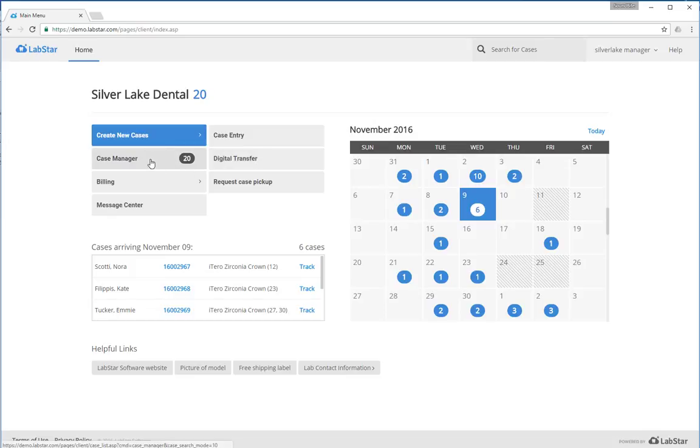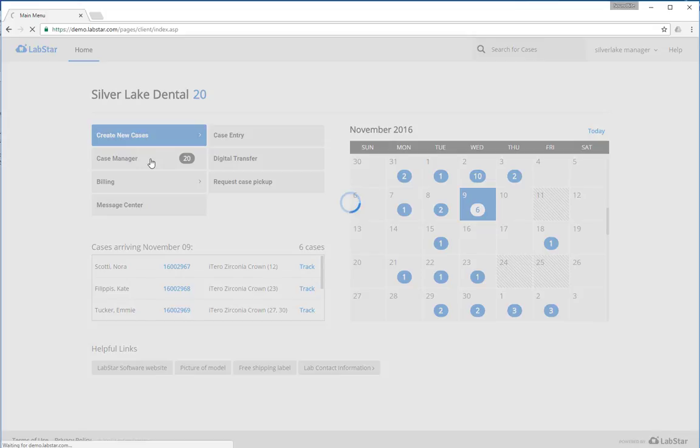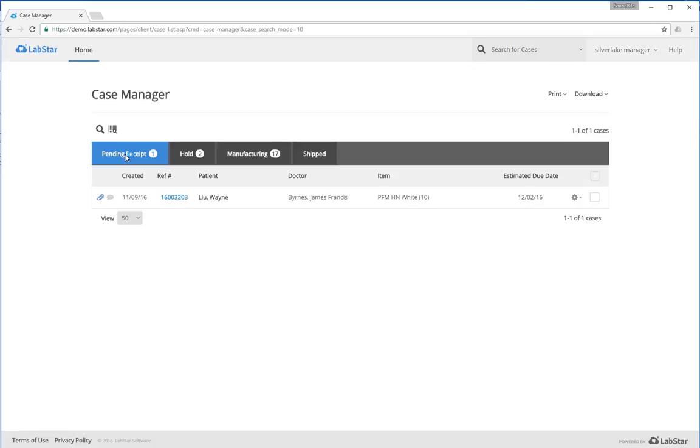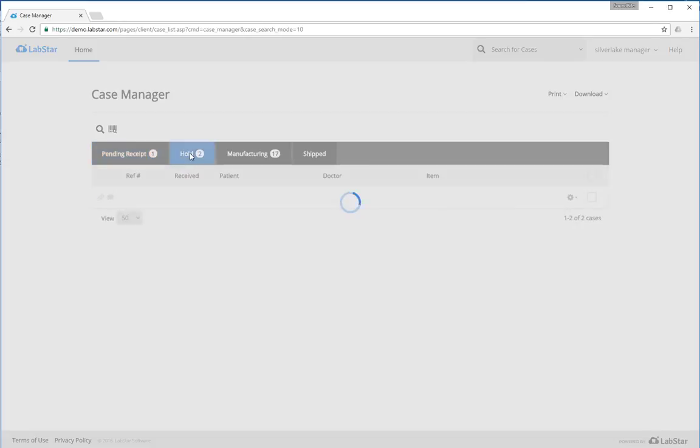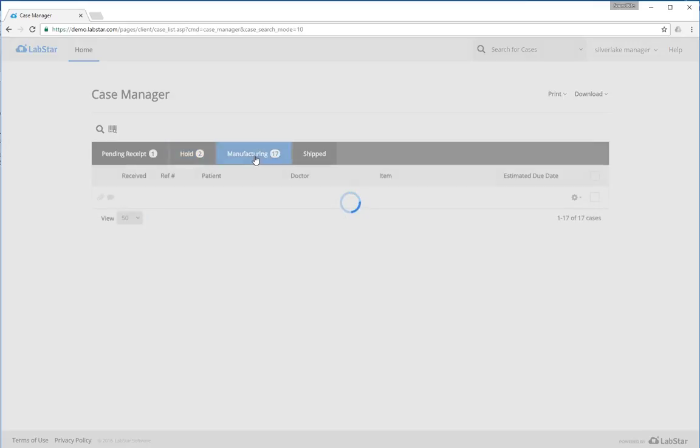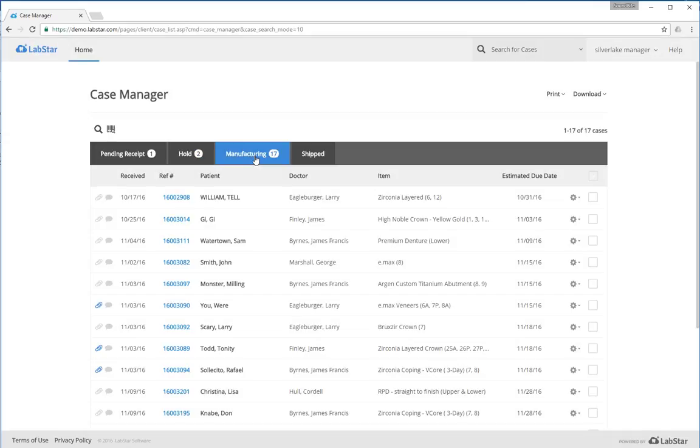The case manager shows you the current status of all of your cases at the lab. So you can see what cases are currently on the way to the lab pending receipt, what cases are on hold for whatever reason, what cases are being manufactured, and also a summary of all shipped cases.